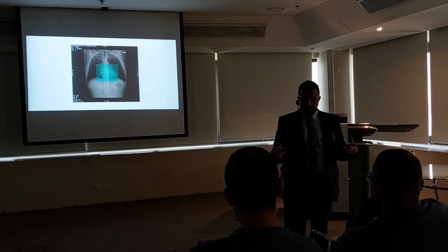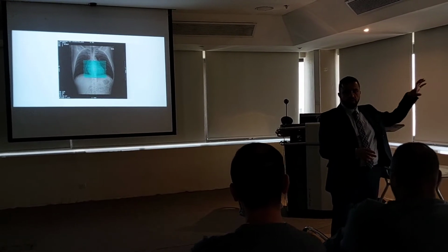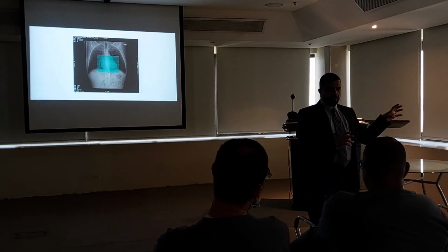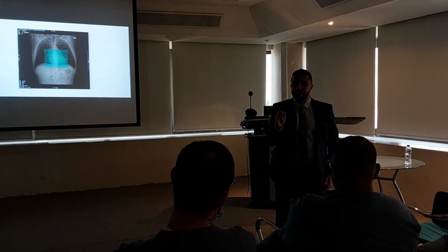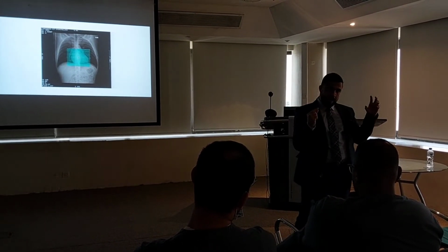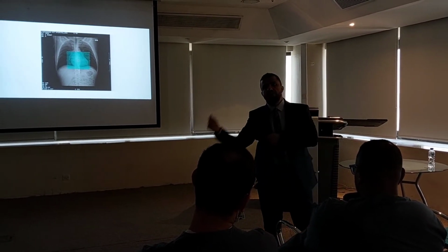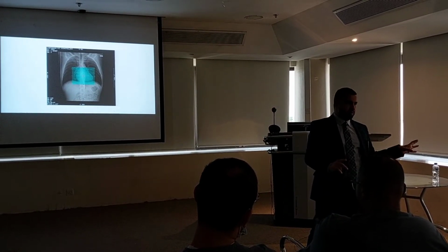Getting this level of calcium in your coronaries will compare you to your race, your ethnicity, your age, all of these things, so you know that because you are in this group, compared to these people, you are at high risk or less risk. So for that, I need to use the same parameters, the same circumstances, so as to give the accurate result of the statistics. That's why we need to keep it 0.4 millimeter pixel size. So for that, we need to use the 25 centimeter DFOV, so as to give a good result compared to your statistics.